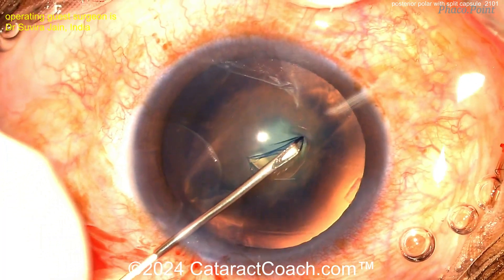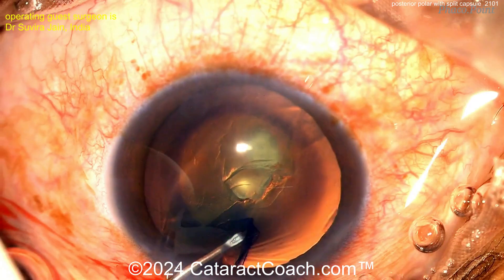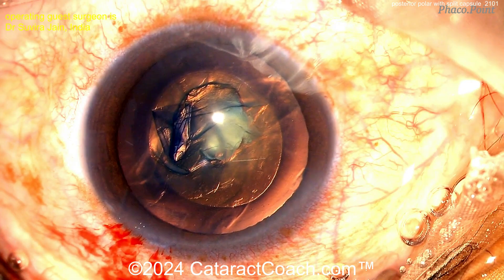Starting off with the rhexis using a cystitome. Make sure you get a really nice five millimeter rhexis because you're going to need to be placing a lens with haptics in sulcus and optic captured behind the rhexis. Beautiful looking rhexis there.